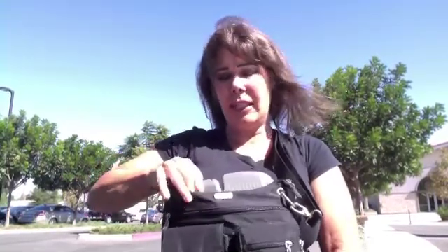So I have a purse that I carry that has equipment in it that actually runs the heart pump. We have batteries. There's 2 big batteries. These weigh about 1 pound each. And then there's a controller device that controls these. The batteries are controlling the controller, keeping the heart pump moving in a patient's heart to keep the blood circulating.